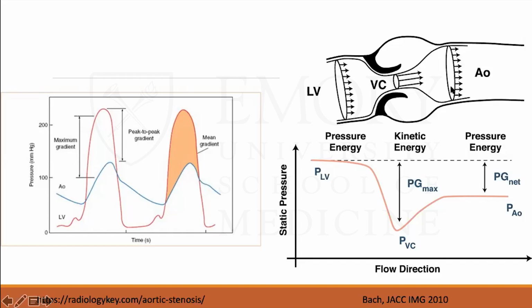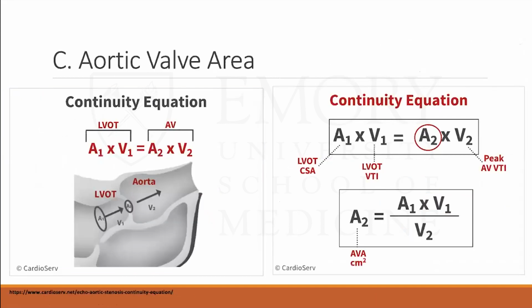By the time you get to where your actual catheter is in the cath lab, sitting in the aorta, some of that pressure has already recovered. That also diminishes the gradient between your LV and your aorta. This happens all the time: we do a TAVR on these patients, and in the cath lab they're getting a gradient of 8 after the TAVR is put in, and then you do an echo on them the very next day and we get a gradient of 12. This concept partly explains that discrepancy.